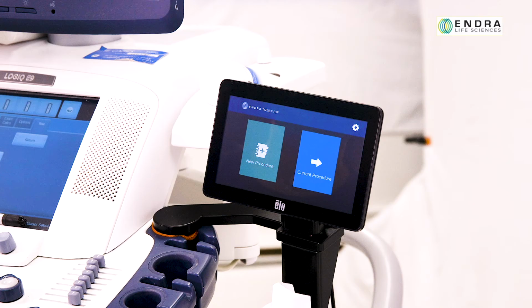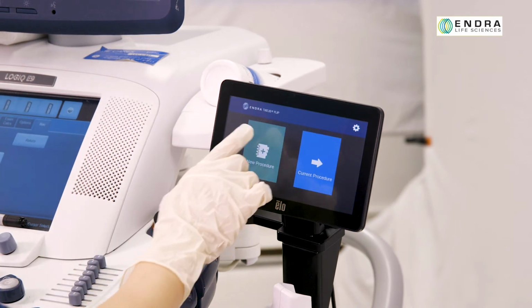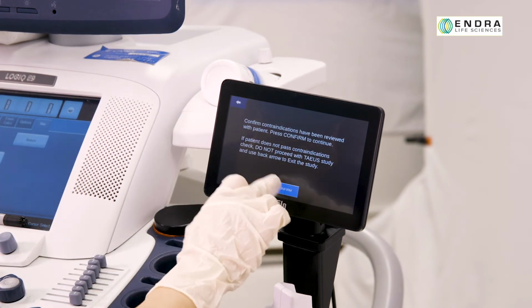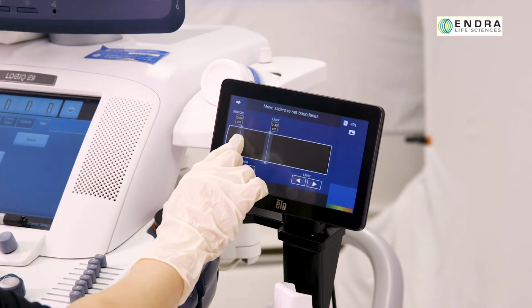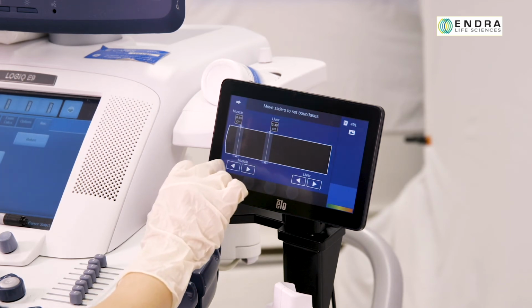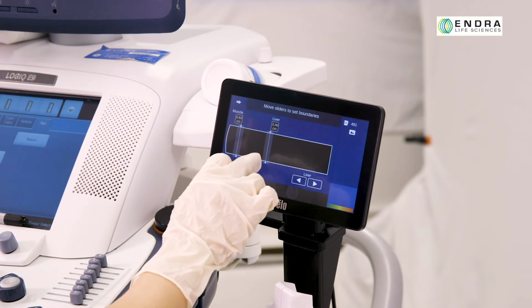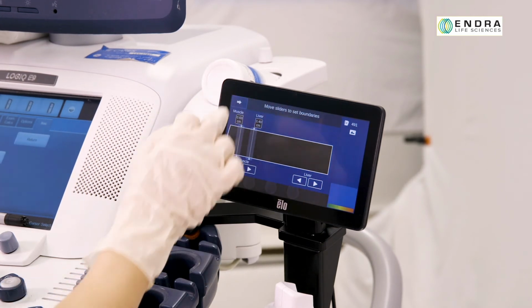We will now use the dedicated TAEUS software to start a scan. Tap the New Procedure button on the touchscreen monitor. Then press Confirm to proceed. On the next screen, drag each of the two slider bars so that the distances displayed correspond to the muscle and liver distances obtained from the B-mode image. Press the arrow keys for fine positioning adjustments. Then press the arrow icon to proceed.